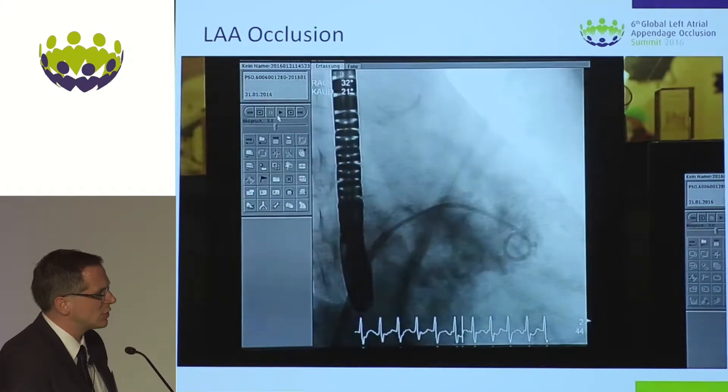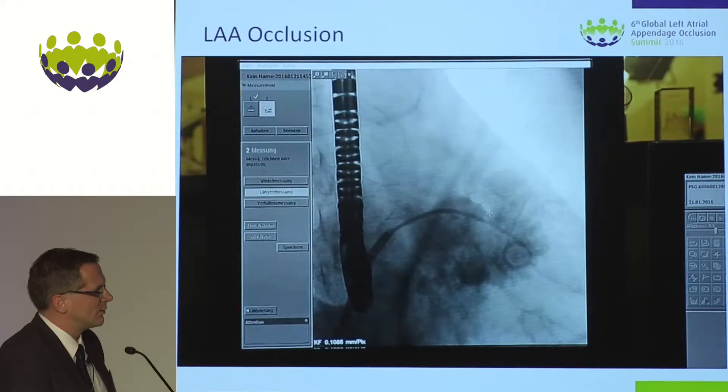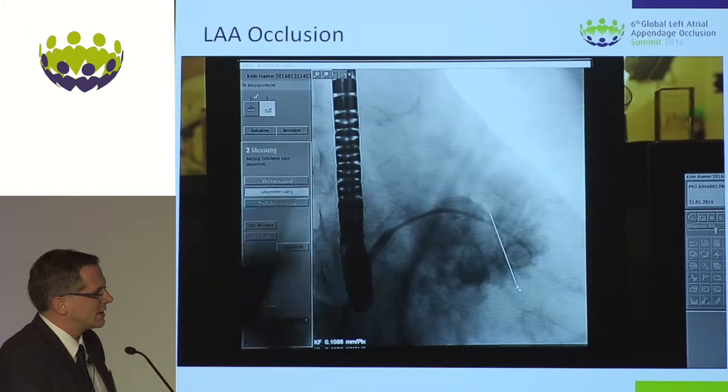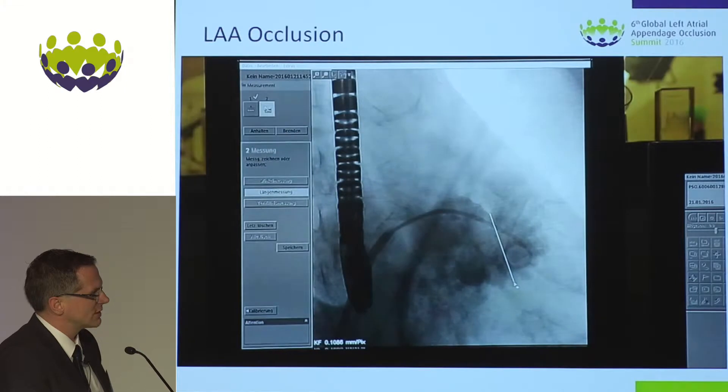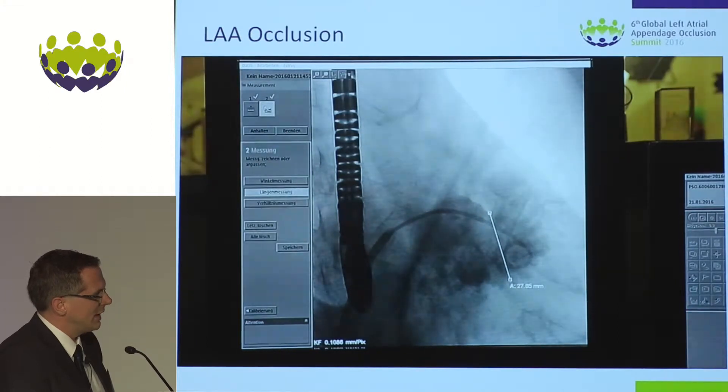As we have both imaging modalities, we want to do what we all call multimodal imaging — considering the measurements in all dimensions and in all echo and fluoro views.